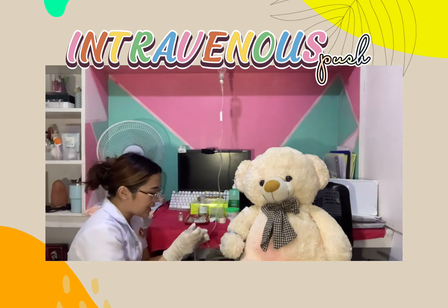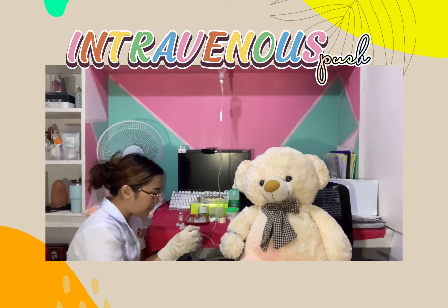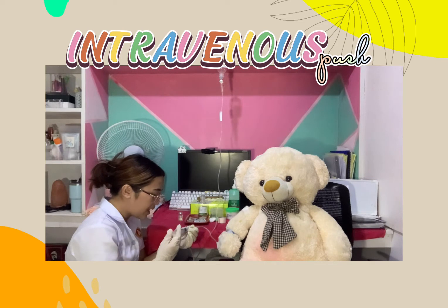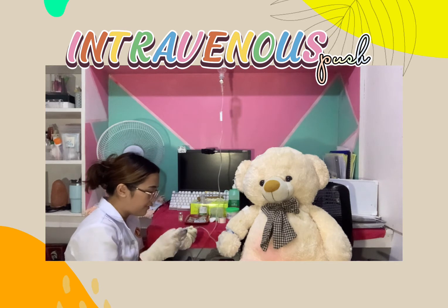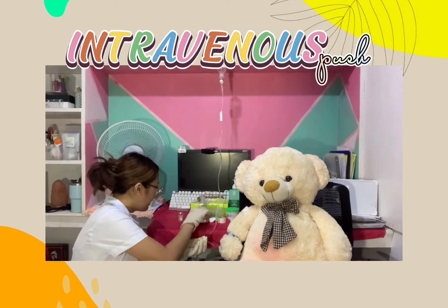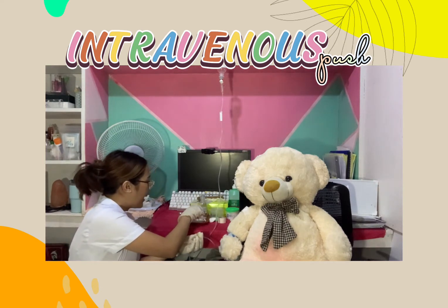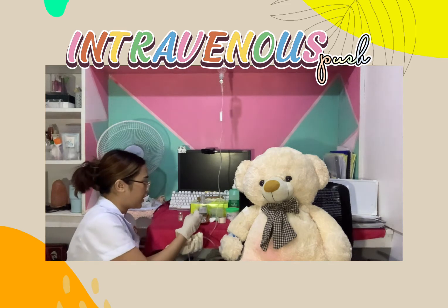So we will just insert the syringe at the center of the injection port. Slowly insert it. And then we will draw up the 1 ml of sterile water for flushing and to aspirate for blood. And then we will remove it. And then after removing it, we can now administer the ordered medication.